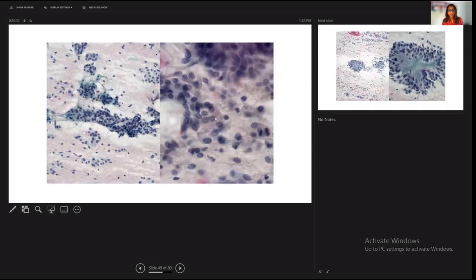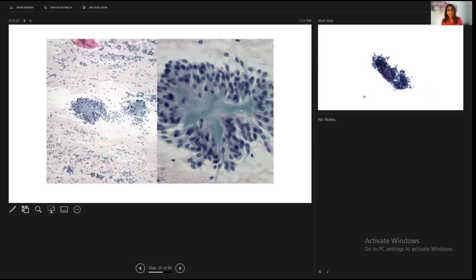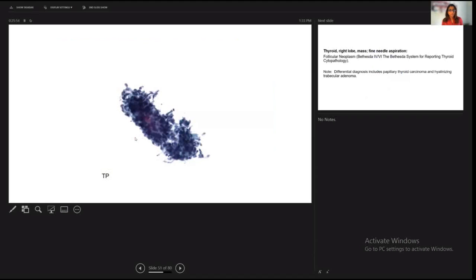Cytology-wise, these cells, again, do have these grooves, paleness to the chromatin, but I did not appreciate any signs of intranuclear inclusions or so forth. There is a central hyalinized kind of stromal material surrounding which these cells were dispersed or aggregated. And you can see the background also has a ton of cellularity. This is the thin prep of this case. Again, you can see the thin prep really condenses cellular material tightly, so you're not able to appreciate that big flowing metachromatic material. Rather, it's all just lumped right in the center. But you do appreciate the nuclear features, which are pale.